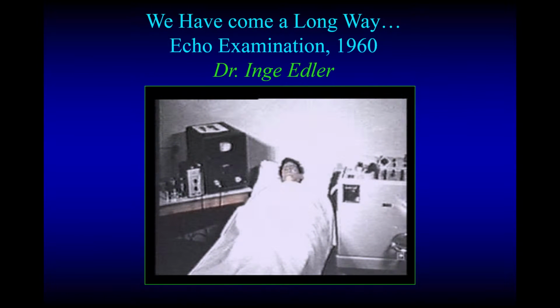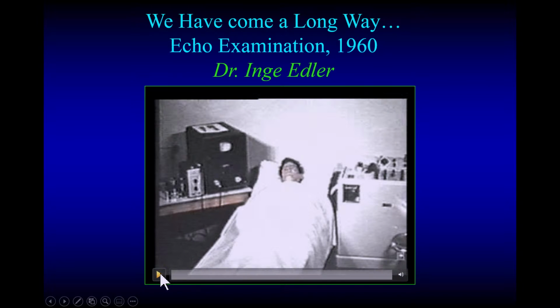I usually like to end with a reflection back, and this is about 61 years now. This is a recording from Dr. Inge Edler, just to re-emphasize, for our developers as well as our trainees and fellows, how far we have come.